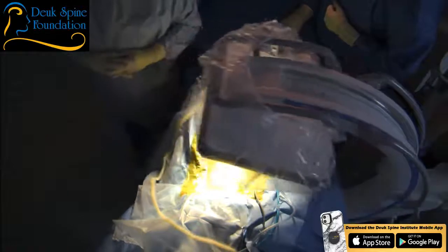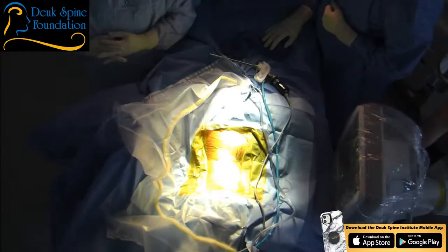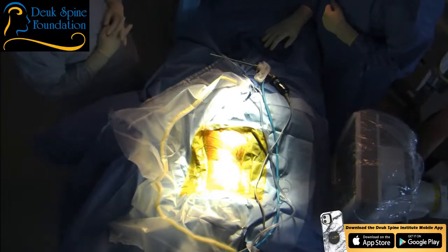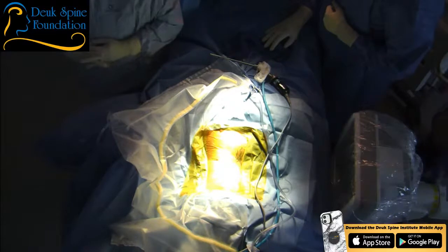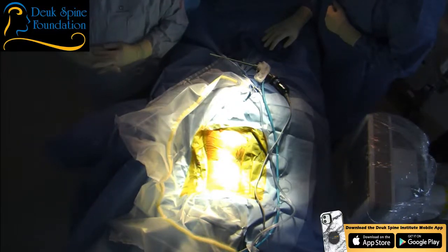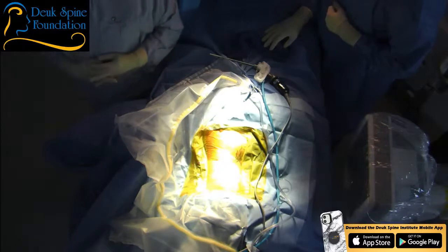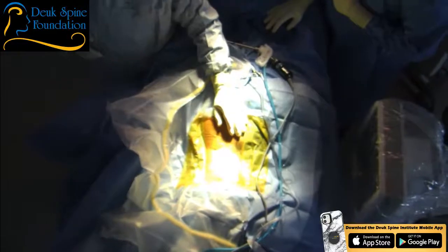So we're going to start by accessing the L5-S1 disc through a transforaminal approach. She has 2 herniated discs, one at L4-5, the other at L5-S1. They're not giant herniations, they're small, but they are substantial and they're causing her to have lower back pain. How long have you had back pain for?